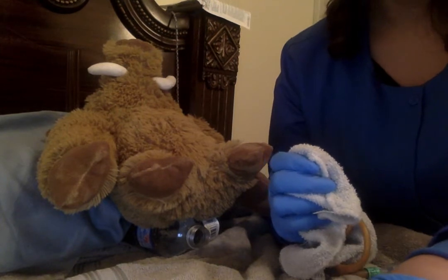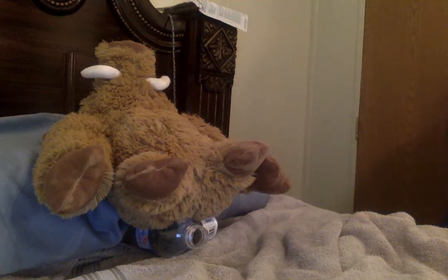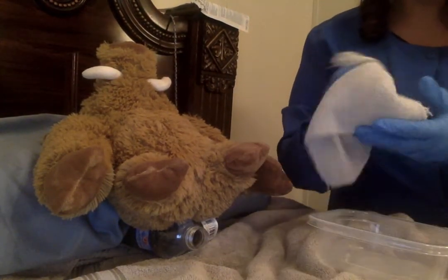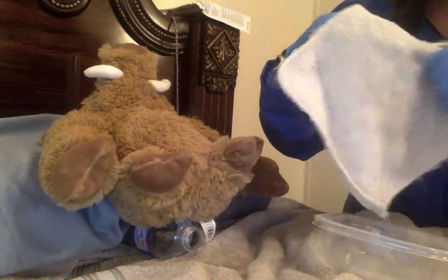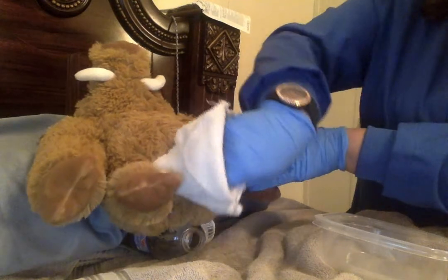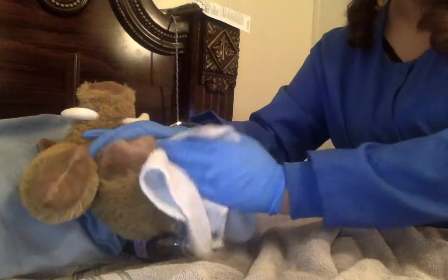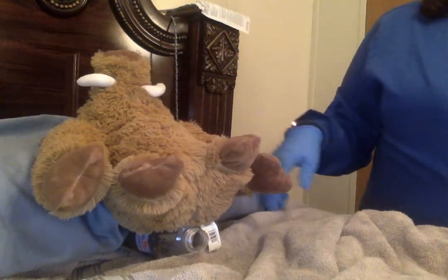So next thing we're going to do is we're going to clean the perineum with soap and water. So we're going to get some more clean water, some more clean towel. We're going to dip it in the water. We're going to clean, switch sides, clean, switch sides, and down the middle. Okay, and then we're going to grab another clean towel and we're going to pat dry.